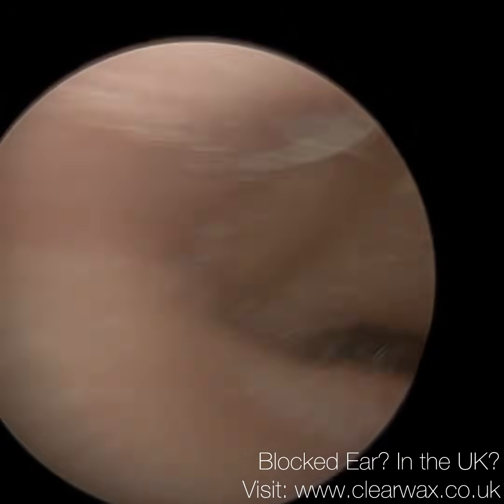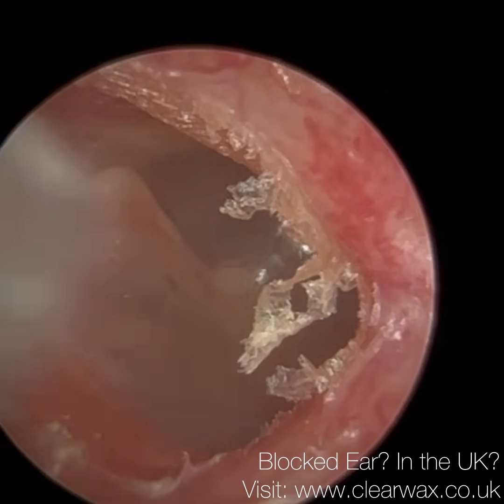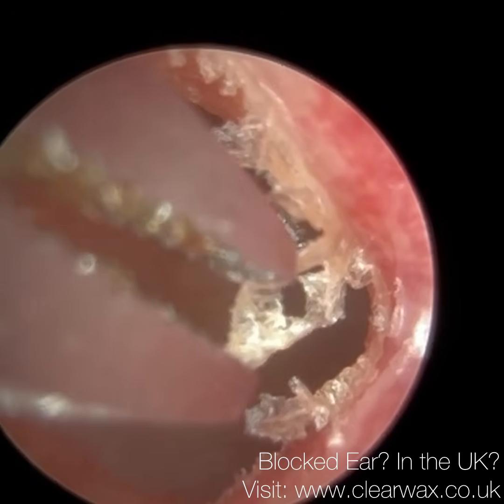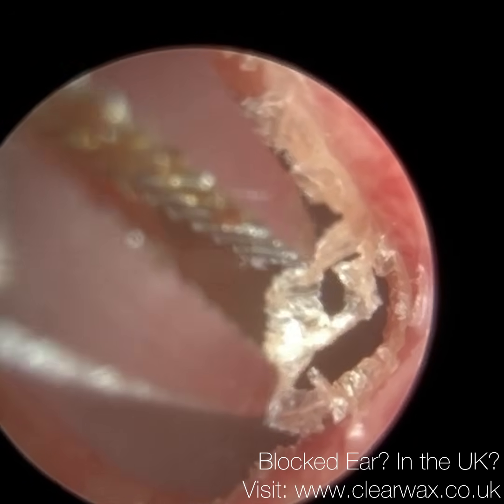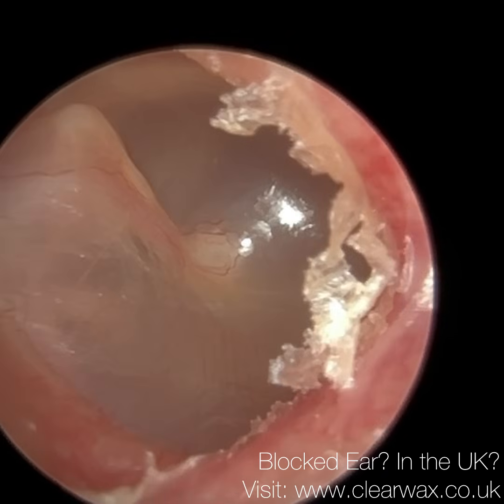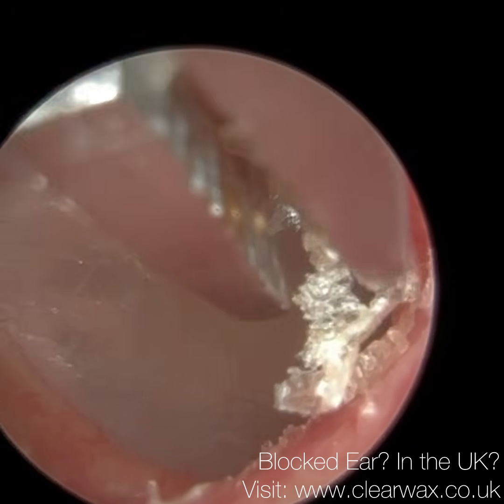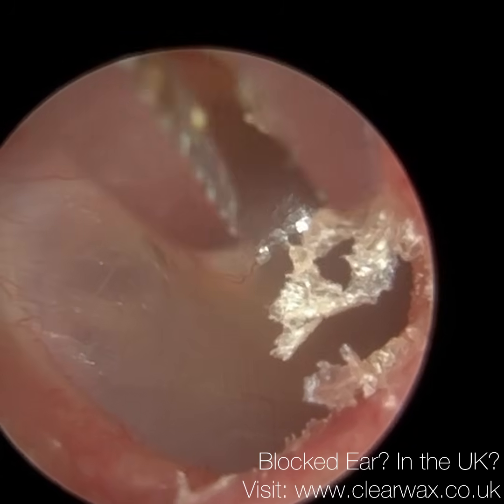And I wanted to do this in a dry method. I don't want to use any drops because there is a bit of a crater there. Sometimes the drops, even with my best attempts to clean it all out, may reside in there, and it's very difficult for the drops to then naturally migrate out. So sometimes I do use drops, and it's really, really tough, but here I've managed to do it completely dry without any drops.